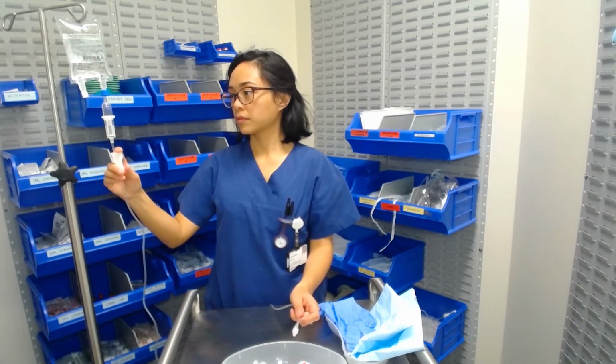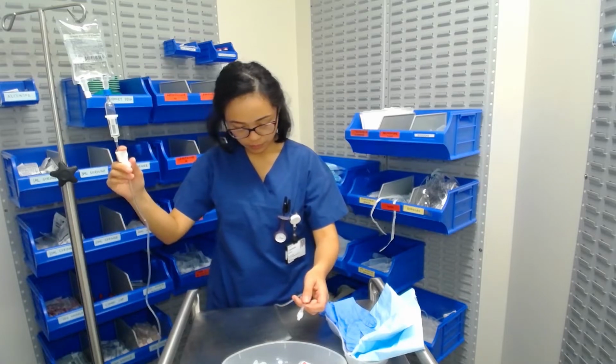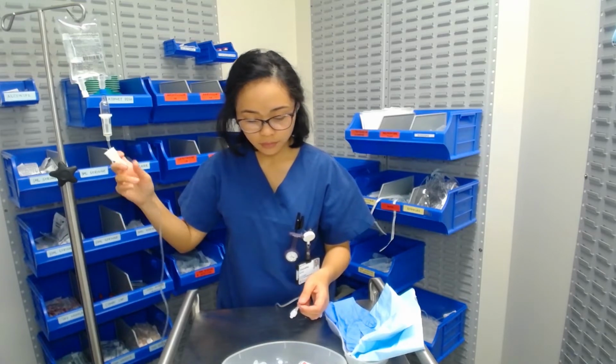Be certain that the tubing is clear of air and air bubbles. To remove small air bubbles, firmly tap the IV tubing where the air bubbles are located. Check the entire length of tubing to ensure that all air bubbles are removed.